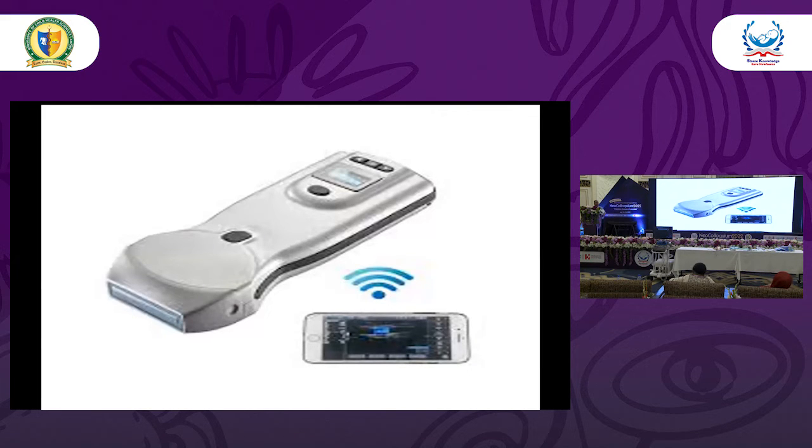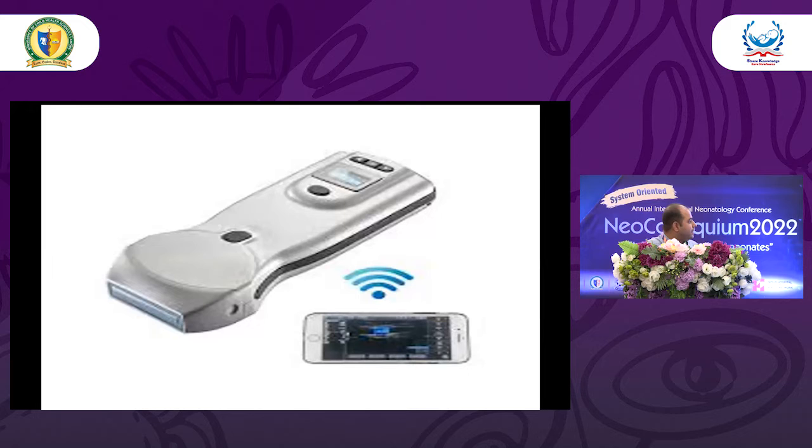And there are machines which are now connected to the imaging display with the help of Wi-Fi as well. But these are obviously not matching the criteria of the high-end machines which we showed you in the beginning, and the one which is displayed right here. It is always recommended that vascular intervention should be carried out on a good quality machine.